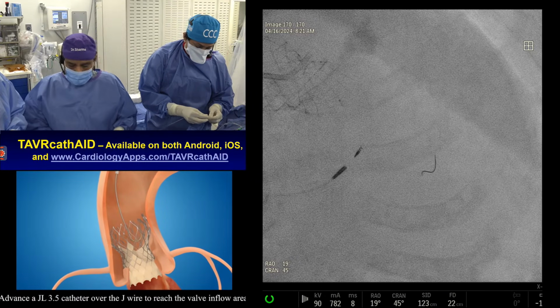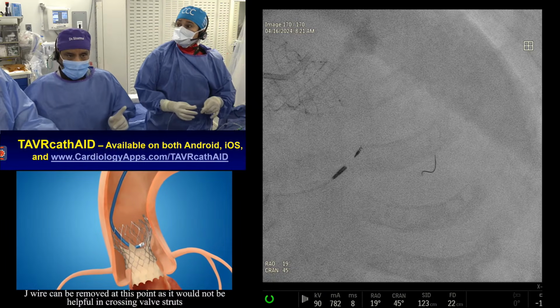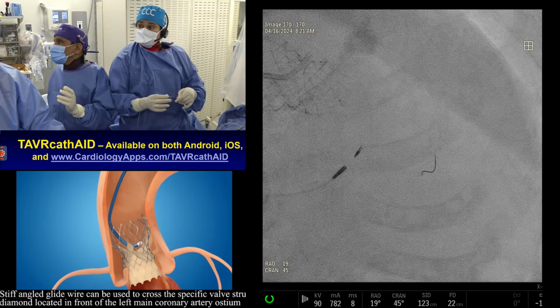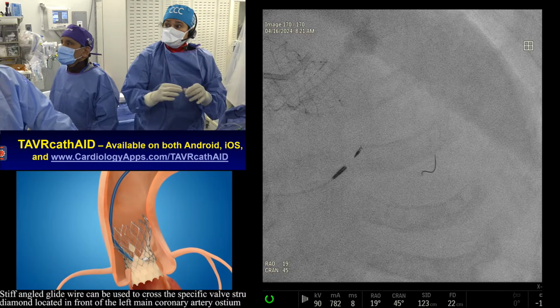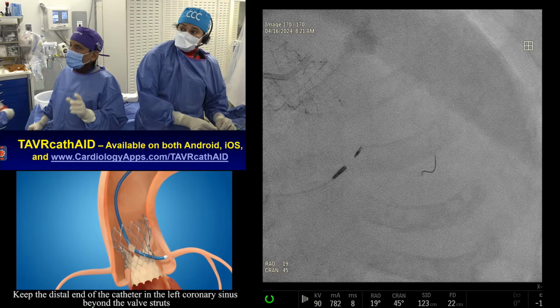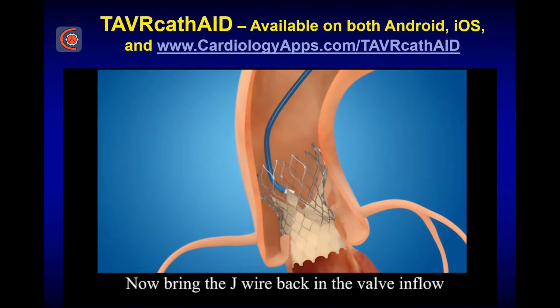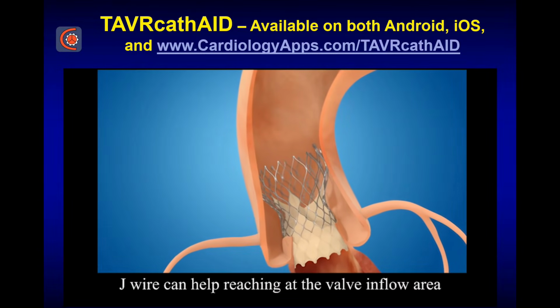Now, these patients are being enrolled at this time in the complete TAVR trial, but it has to be a Sapien valve. Can we show the animation full screen? While they're bringing the animation full screen, just to say, there is an ongoing trial, complete TAVR, for this kind of case, not the left main: should you even do a PCI? That's being evaluated at this time, medical therapy versus PCI in those cases.